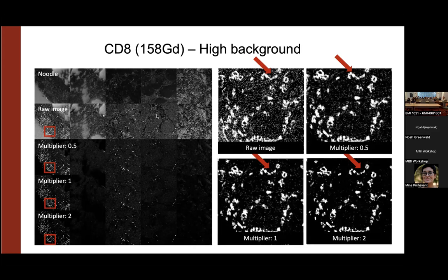With all these examples that I've shown, I hope you can appreciate how the default coefficient is working quite well, just out of the box. The matrix that we applied to the DCIS cohort was straight from the matrix, actually, Noah, you used for the TMDC. We made absolutely no adjustments. And just to show you that even for the first pass, just to see how the default matrix looks, I think it's a very good idea before you start adjusting. And even the multiplier that we applied here is actually quite small.